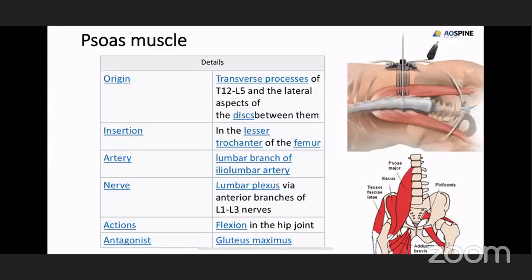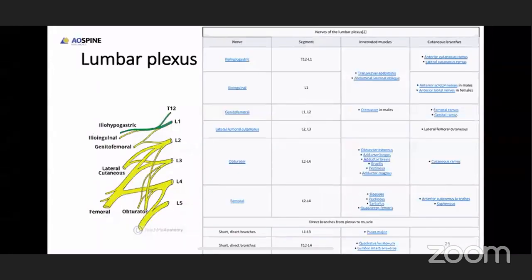This shows the deep dissection. The psoas muscle is retracted posteriorly, and that is the disc space — this is an infected disc, that's the reason it's eroded. Anteriorly, the yellow color is the fat. You should always know the anatomy of the psoas. It originates from T12-L1 to L5 and inserts at the lesser trochanter of the femur. Whenever you injure the psoas, the patient always has problems with hip flexion. By doing OLIF you don't damage the psoas, therefore postoperative pain during flexion will be really less.